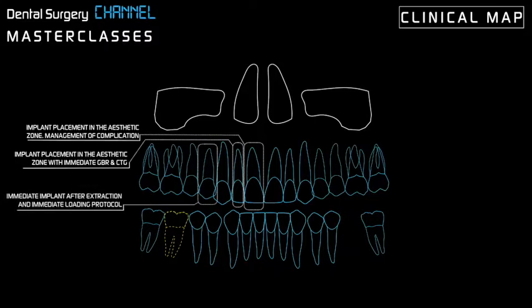Also, an immediate implant after extraction, with an immediate loading protocol. It's important to know that more and more often we're going to see patients in our clinic who require and are demanding these immediate loading protocols, especially cases where a missing first premolar is clearly seen in their tooth display when they smile. This is something that we need to know how to do.